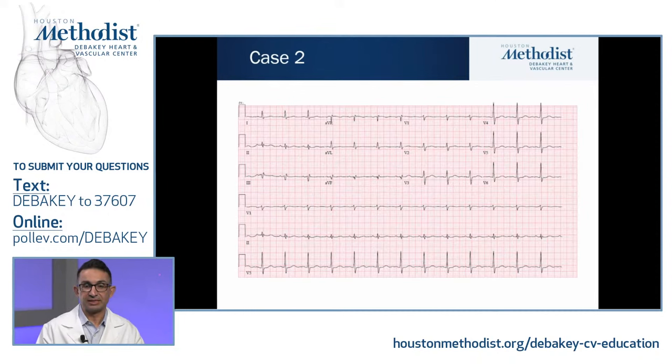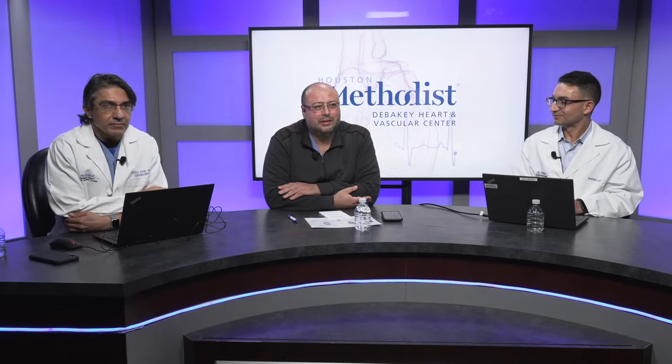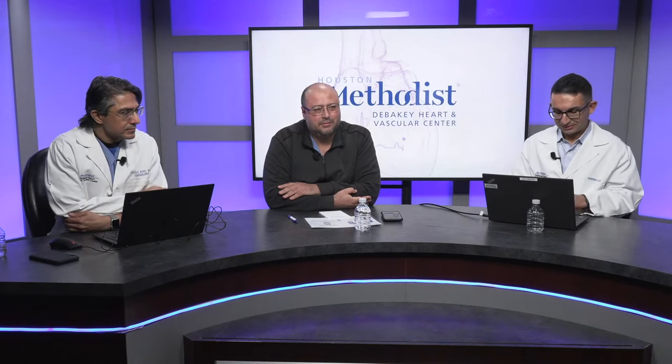This is his baseline ECG. His baseline ECG remained relatively unchanged throughout the stress. So even before you move, we are sure this patient had atherosclerosis. Atherosclerotic disease, exactly. It's already been documented in one vascular bed and probably present in the coronaries to start with. Now the point is, are these symptoms related to atherosclerosis or not? So it's very important to look for these. Exactly, yeah.